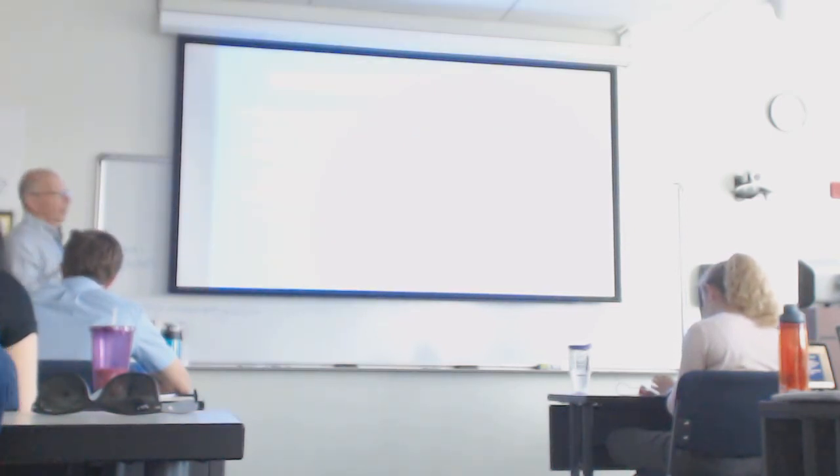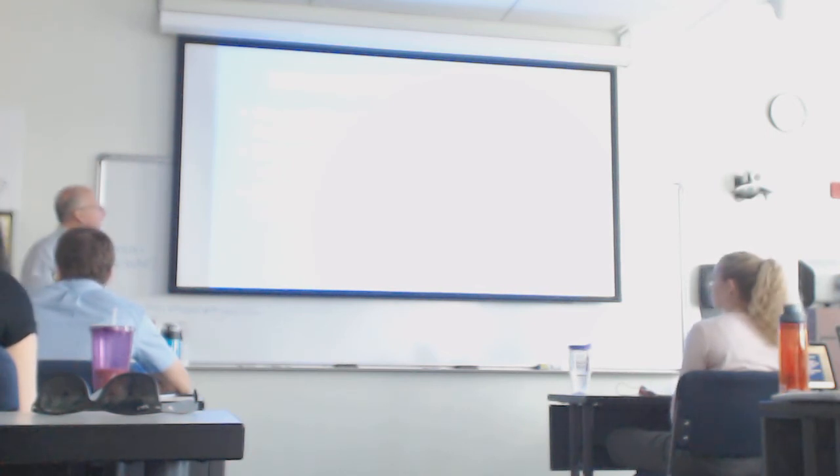Okay, let's talk a little bit about MR, and some of these pictures will be prettier. We don't have to go into why or how.